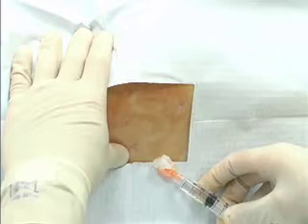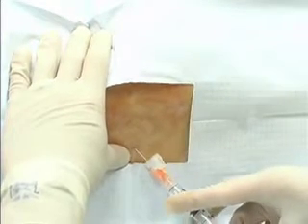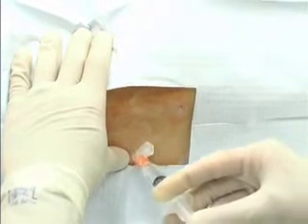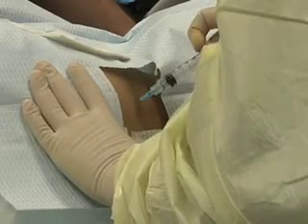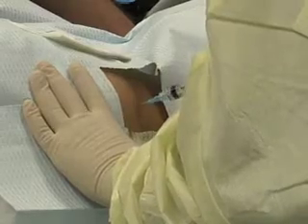After sterile preparation, 1% lidocaine should be slowly injected to raise a wheal over the biopsy site. Then, infiltrate the periosteum with 2 to 5 milliliters of buffered lidocaine. In the awake patient, ensure the adequacy of local anesthesia by gently tapping the periosteum with the tip of the needle used to deliver the anesthetic.